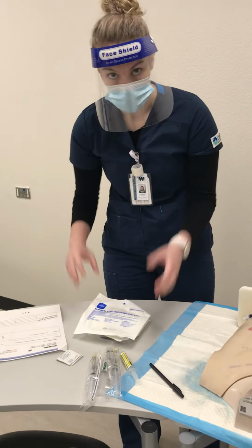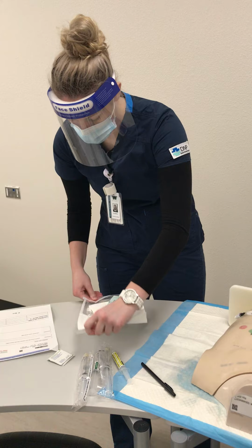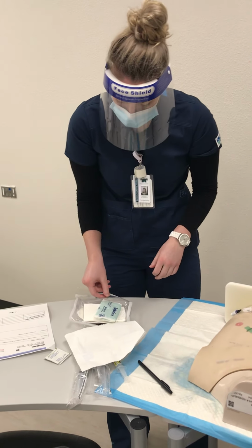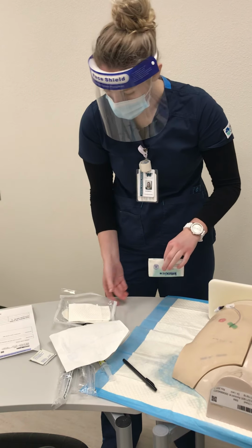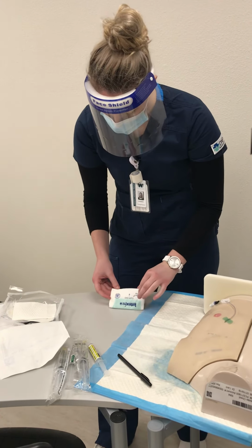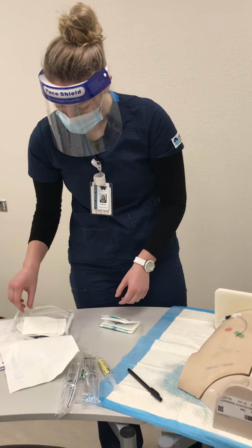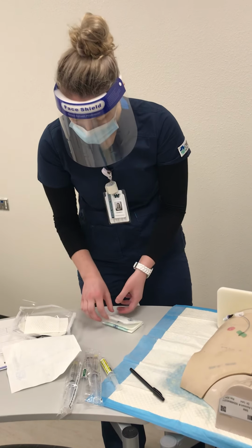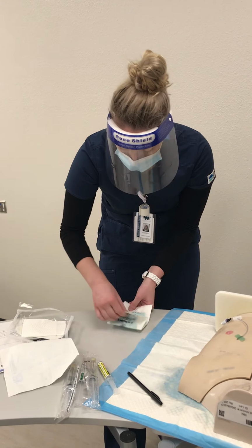So we'll open our dressing kit now. Okay, and take out our gloves. Before we open our gloves, or sorry, actually yes, we want to do our gloves first, and then I will lay down the sterile drape.